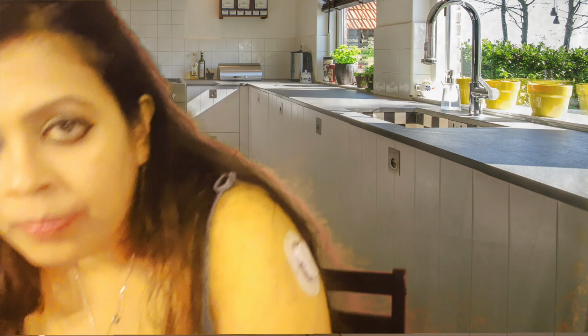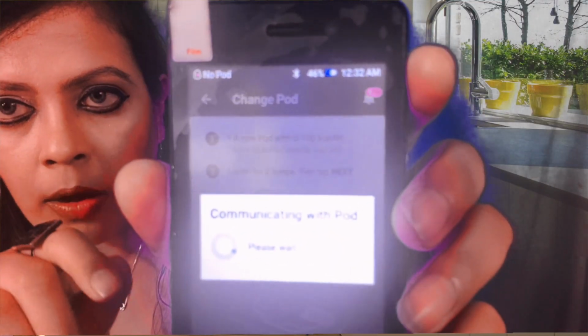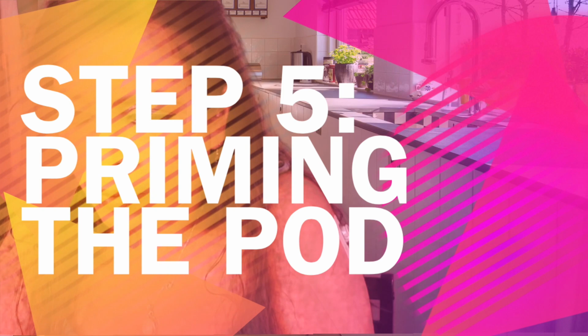I am capping this back and putting it there. All right, now this, guys, is going to be my trash box. I also put the vial back in my pouch. So all this is out of the way. Okay, so now, as I showed you guys before, I hit set up pod, and now I just have to hit next because I have put insulin in the pod. Now I'm waiting for it to prime.